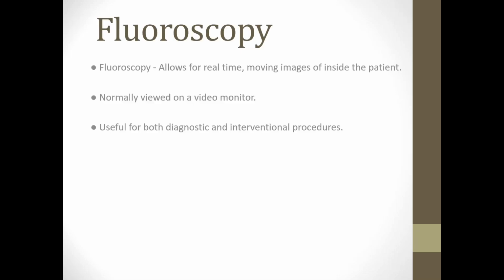What made this all possible was fluoroscopy. Basically, fluoroscopy is moving X-ray. You can think of your phone camera: you've got your photo mode, which takes still pictures, and then you've got your video mode that takes moving pictures. Well, this is what would equal the video mode on your phone.